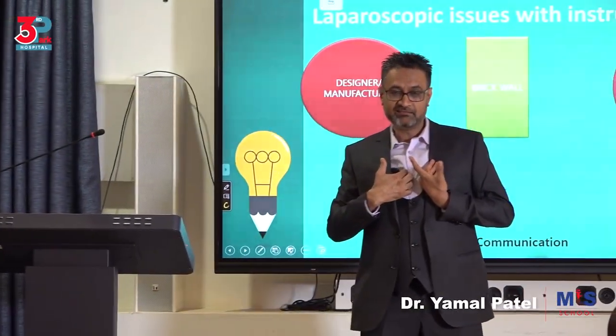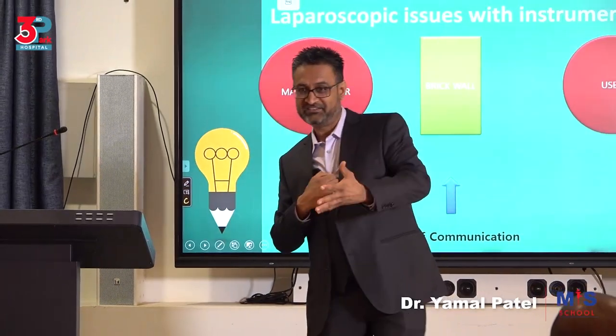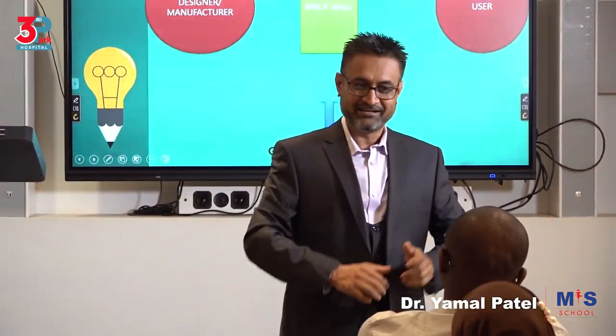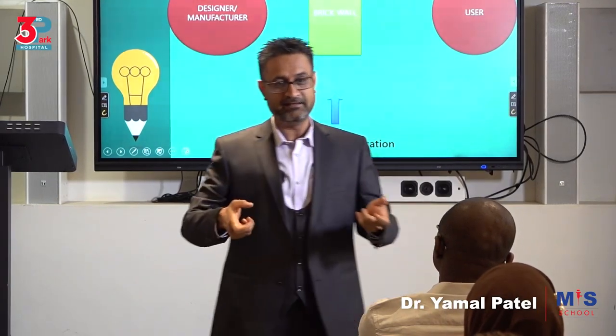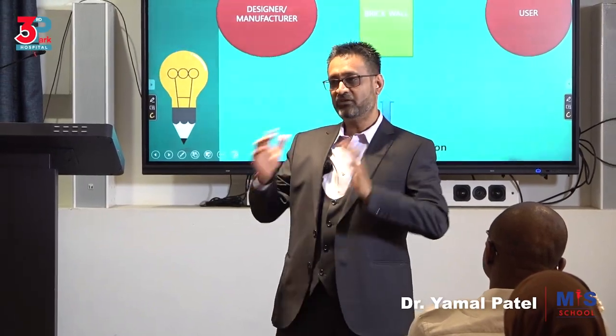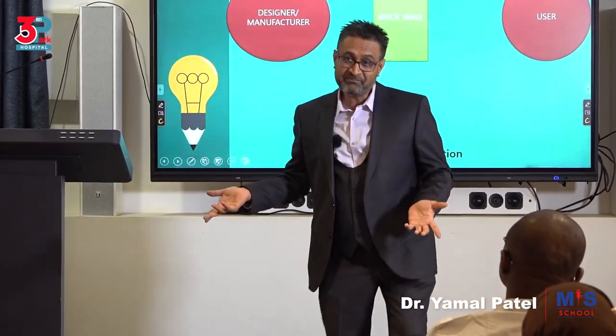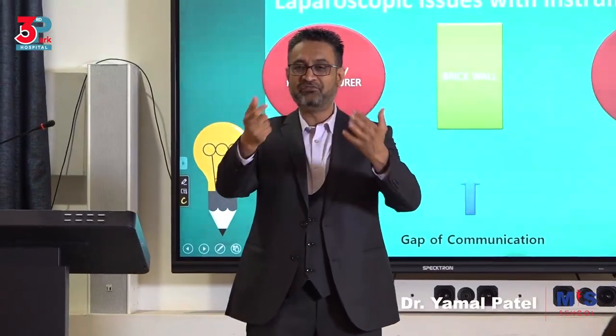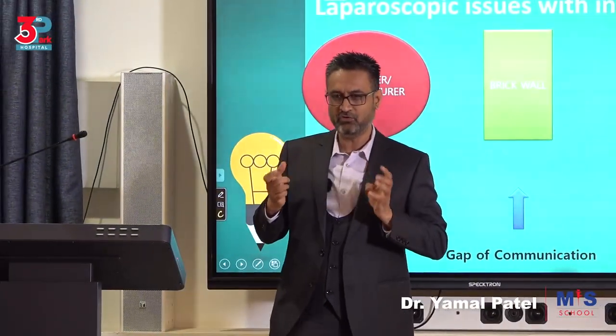I foresee a future where the manufacturers will probably come and say, sir, you know the way they make your suit for you? They'll come and say, sir, can I take the measurement of your hands? I want to make you customized instruments that will fit your hand. Wouldn't that be the best? So when you go into theater, you're told, okay, remove Yamal Patel's set of laparoscopy. But jokes aside, guys, ideally that should be happening. What I meant was, why not have customized sizes based on how your fingers and hand size are? You get what I'm saying?